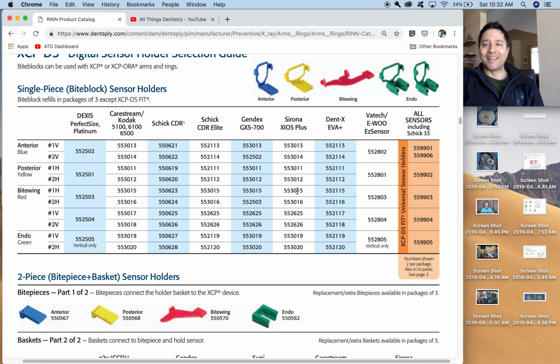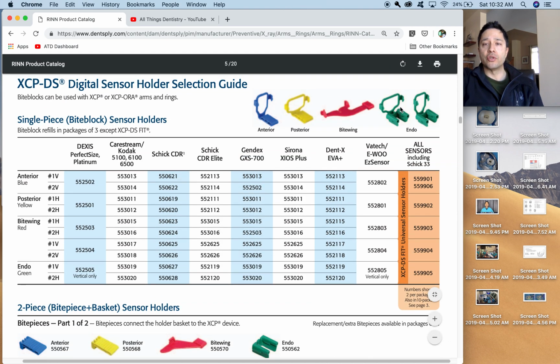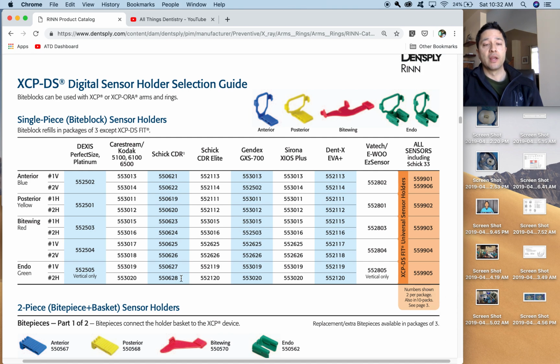We'll zoom in, and let's take a look here. So we've got the number 2. These are the two baskets here for the digital sensor holder. This is for direct sensors, and this would be a number 2 and a number 1 sensor. And what we used was the Schick CDR. So we would go down to the endo green, and we'd look at purchasing the 550628 for that video, for example. So you have the number now for the ring and the metal connector joint piece, and now it's very specific.